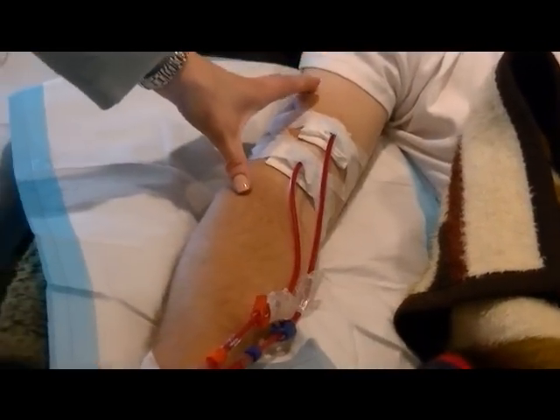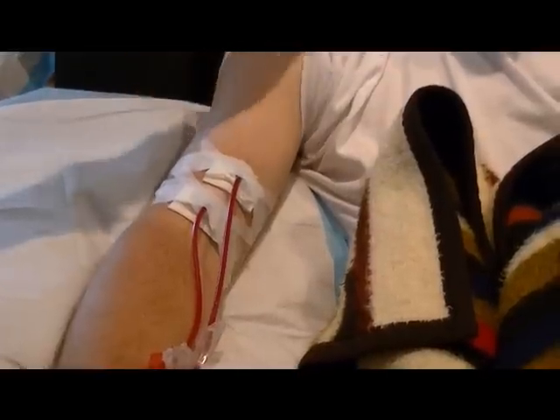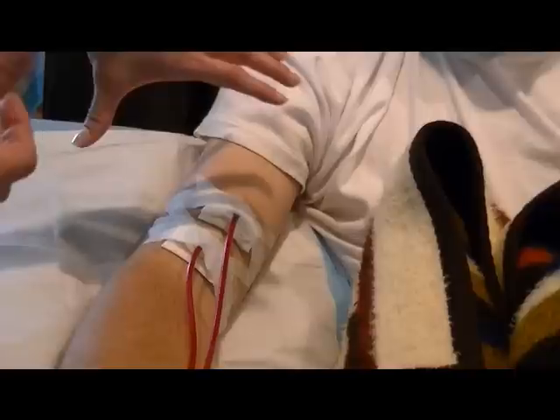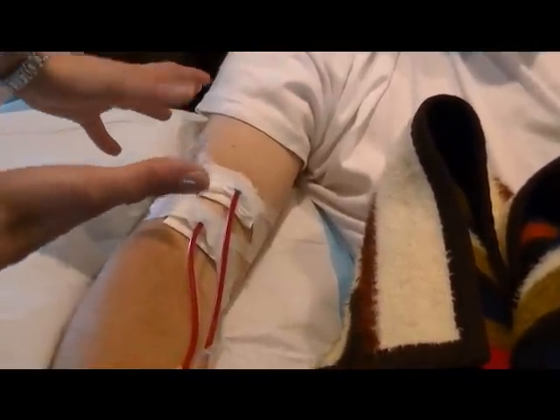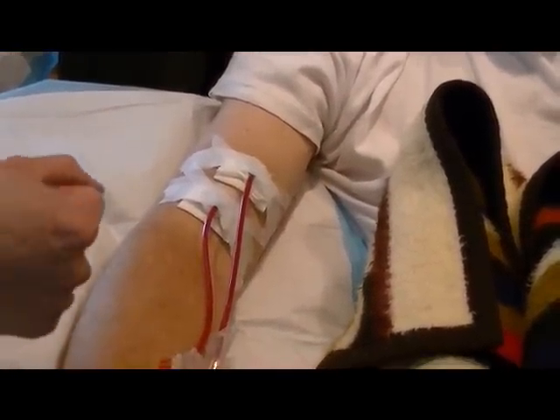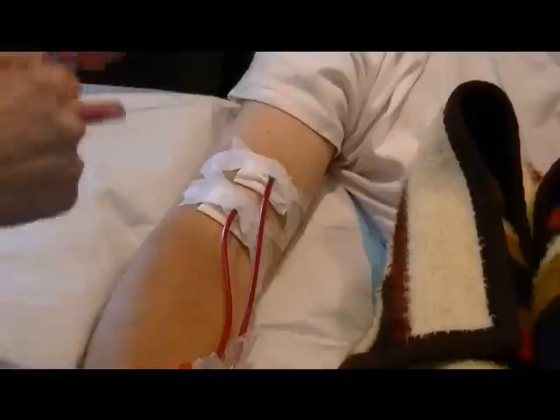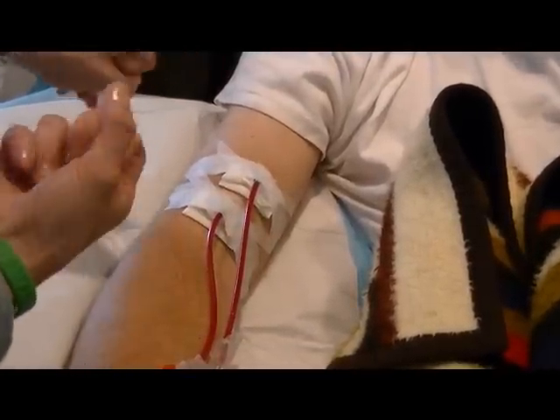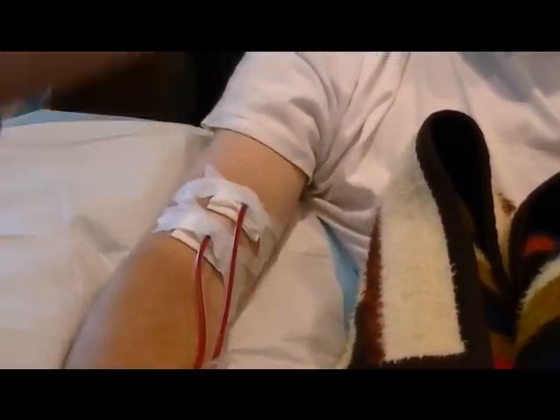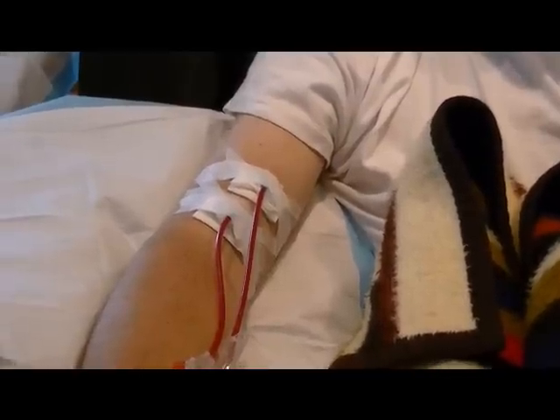His fistula is what we use here in his arm. He had a catheter in his chest beforehand and they want to take those out as soon as possible because of the high risk for infection. The reason you keep watching your pressures is because if he infiltrates, his arm will just start filling — all the blood will be pumping in there at 500 milliliters per minute, his arm gets huge and it turns into a really bad bruise. We've actually had that happen. A good thing about the fistula is that you can run at a higher speed than the catheter in the chest, so it takes longer whenever you're using the catheter.